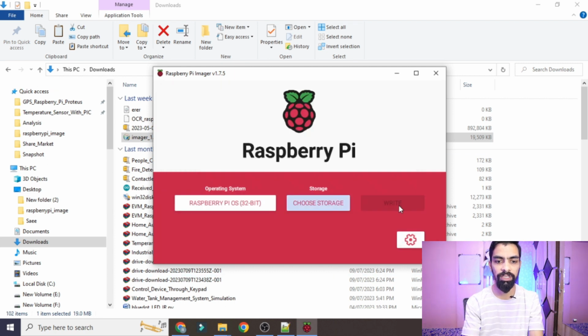Once you click on this Write button, Raspberry Pi OS will be written to your memory card. It will take some 30 minutes, and after that you can plug out the memory card and place it into the Raspberry Pi. Attach a keyboard, mouse, HDMI cable and power supply to the Raspberry Pi, and then do some basic setup: your language, whatever keyboard you are using, and time. Then you can install the library. So this is the way you can install the OS into Raspberry Pi.